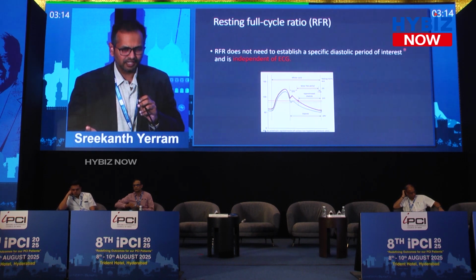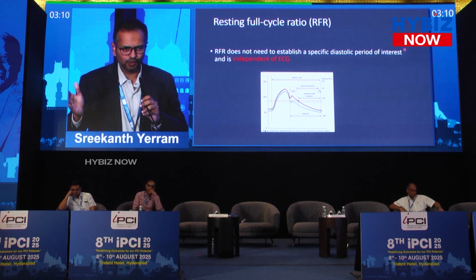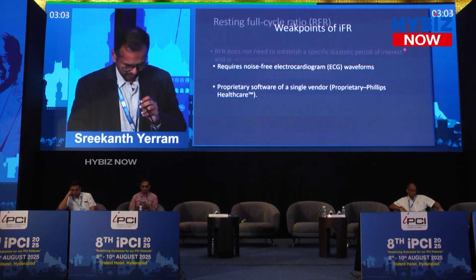So the same thing with RFR. The way it's measured is different. It takes the whole cycle, but it's going to take the lowest value in the cycle. So it literally measures the same thing.